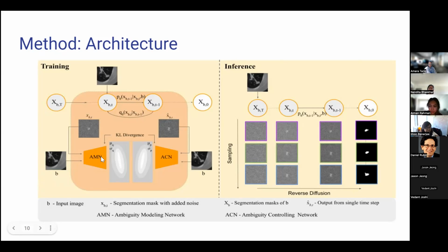You start with the full image itself? I don't think so, because you're passing a huge image that can have a tumor at some location. If you take a big CT scan, crop it into patches, and pass them to the model, wherever it sees the tumor, it will just segment that part. And during inference, are you feeding all the patches from the images, or only the patch which has a tumor? No, all the patches. Okay, got it.